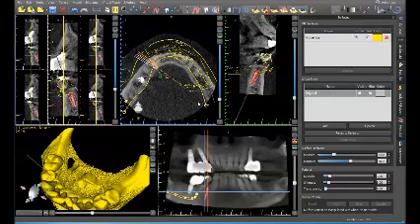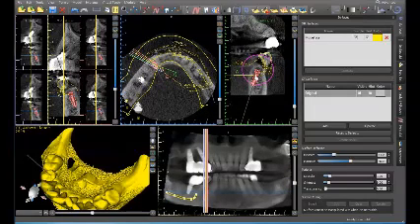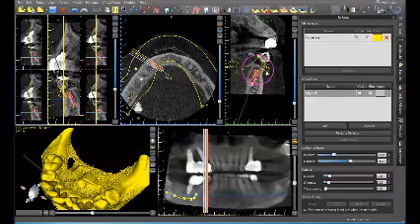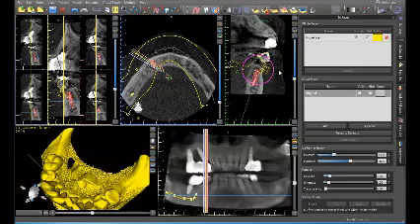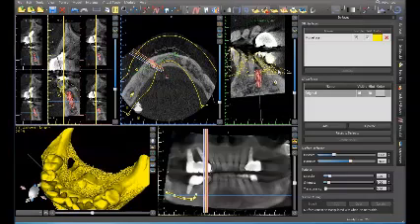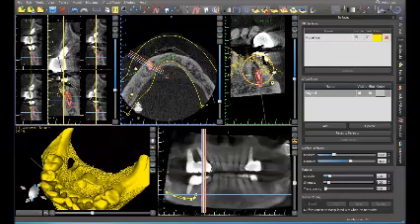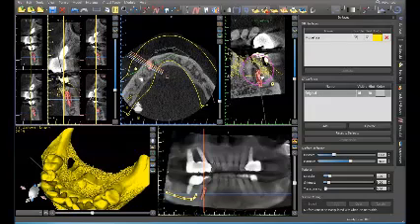So now what I'm going to do is rotate this around to see how well I am. And in this view, right here, where this green line is, even with these arrows, this really should be in the middle. And then as I rotate with my mouse, you can see how close I am to the canine. So I'm going to push this back a little bit. Re-angle this just slightly. You can see the anterior loop here. So I can back this off to 11.5 if I wanted to.